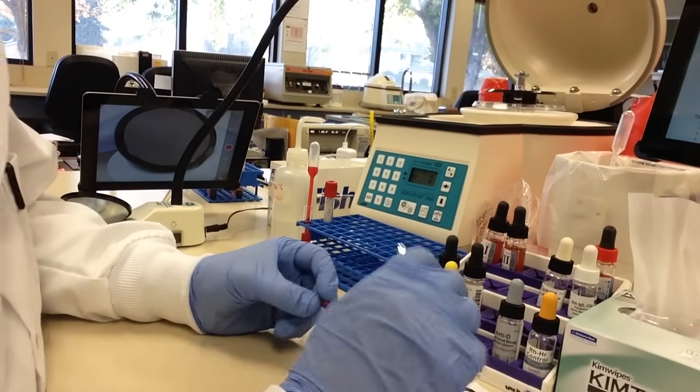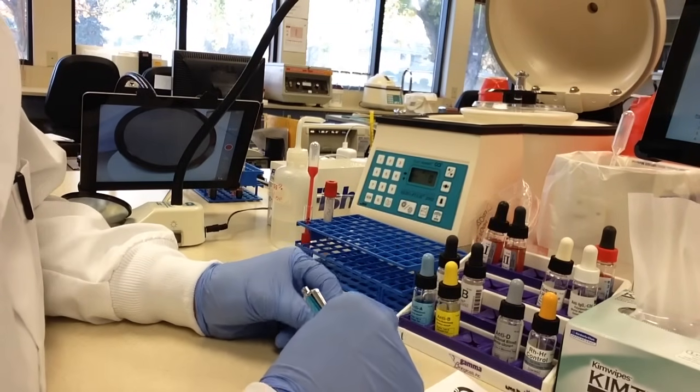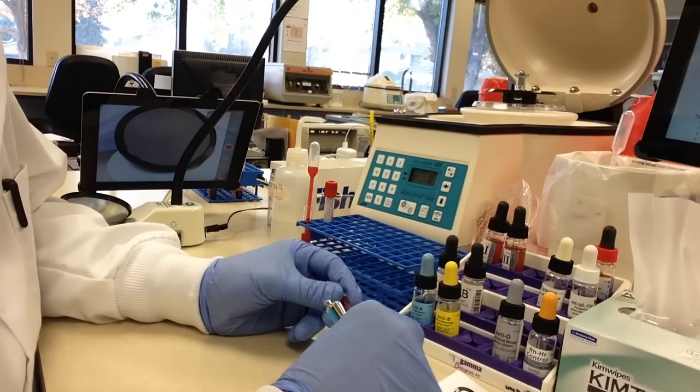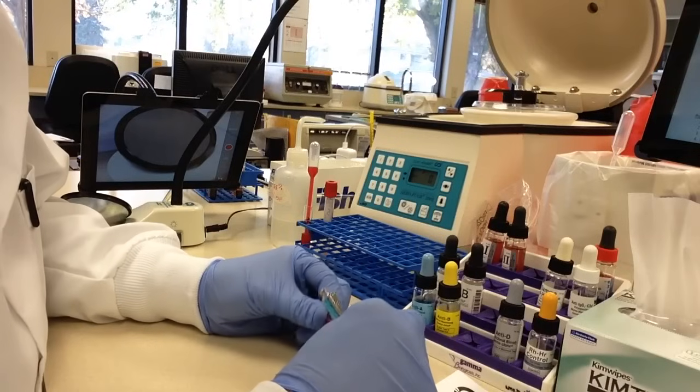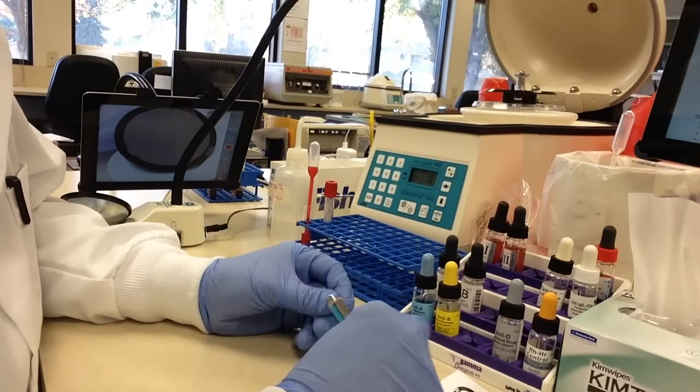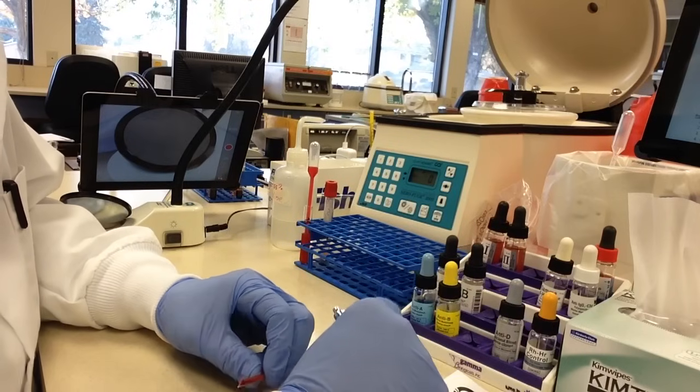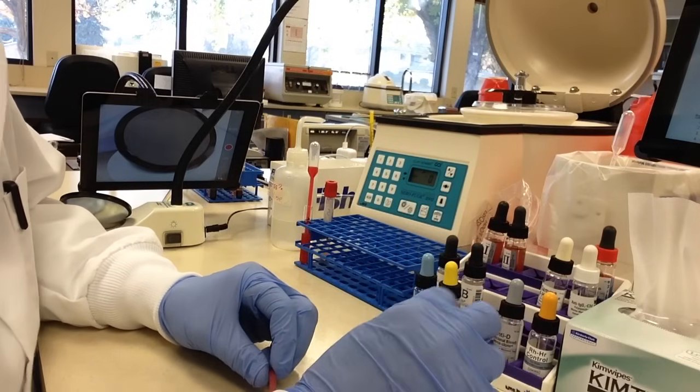In this video, we are going to be doing a unit cross match. The procedure for this can be found on Canvas — it's called cross match tube method. For our patient who needs the blood, we have already done the type and screen and the antibody screen is negative, so we can go ahead with our cross match.